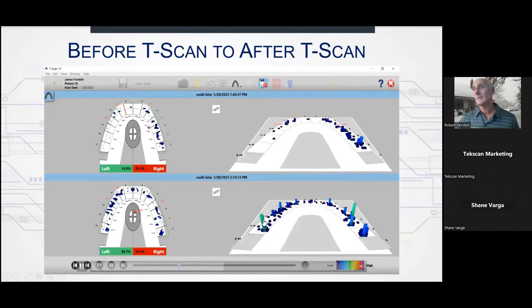And so the timing of this, not only the simultaneity timing, but the occlusion time, is much shorter in the post-treatment condition when you know how to map the right contacts to the right carbon paper marks. And there you see this is the first forceful contact to show up. And this whole movie is over, long over. And this one is just beginning.